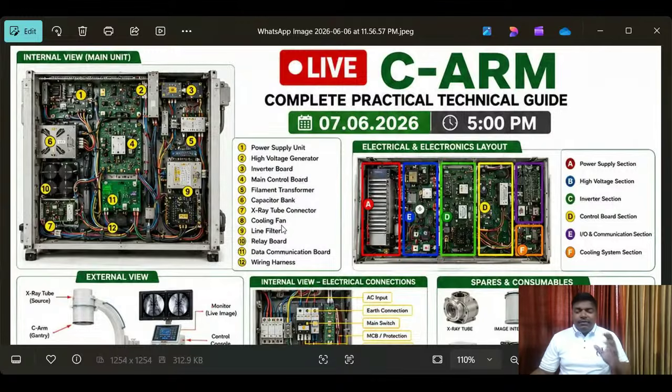See, for example, if you get a complaint, I have given you the common problems. So first of all, you have to check all things one by one. If you check and it is still not working, then you have to come to the console area. In the console area you have to find out one by one when damage is possible. If you know all these things, then you can find out the issues and you can provide the services. That is the reason. Okay, right.